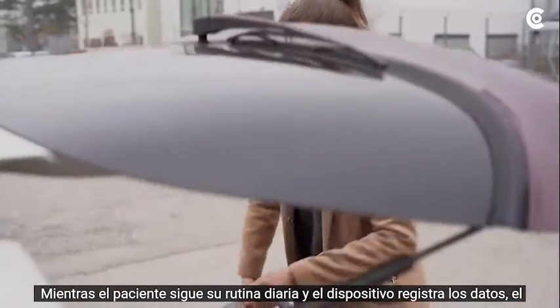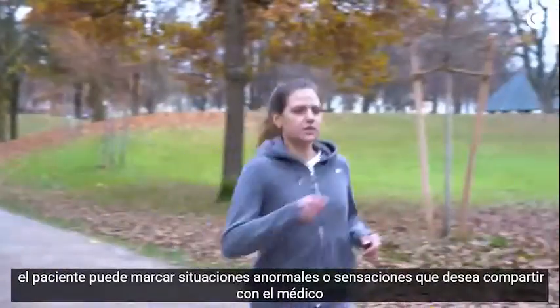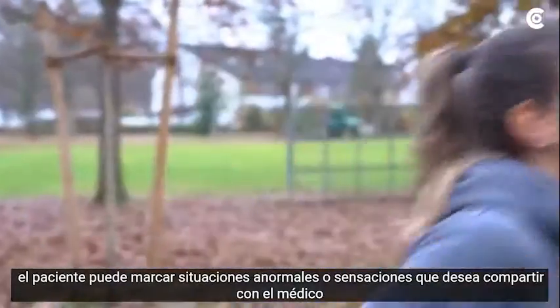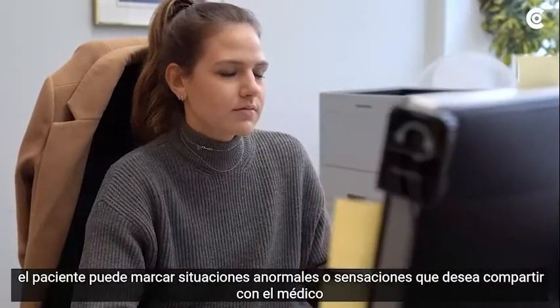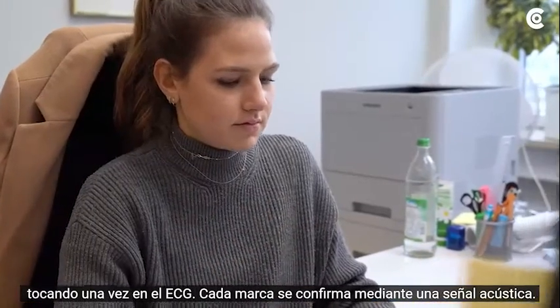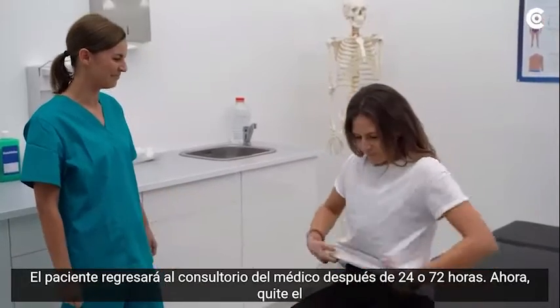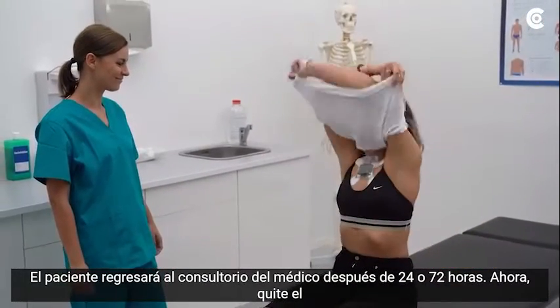While the patient follows their daily routine and the device is logging the data, the patient can mark abnormal situations or sensations they wish to share with the doctor by tapping once on the ECG. Each marking is confirmed by an acoustic signal. The patient will return to the doctor's office after 24 or 72 hours.